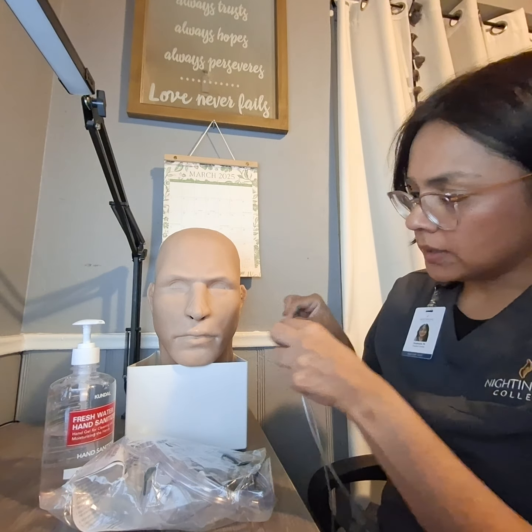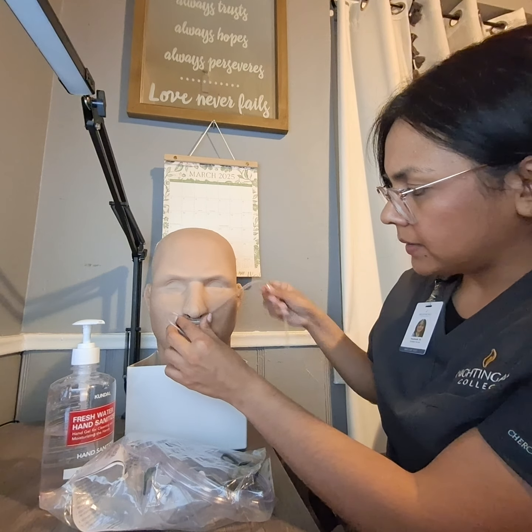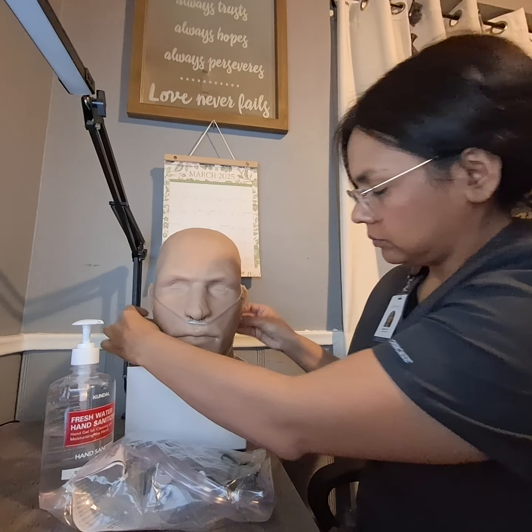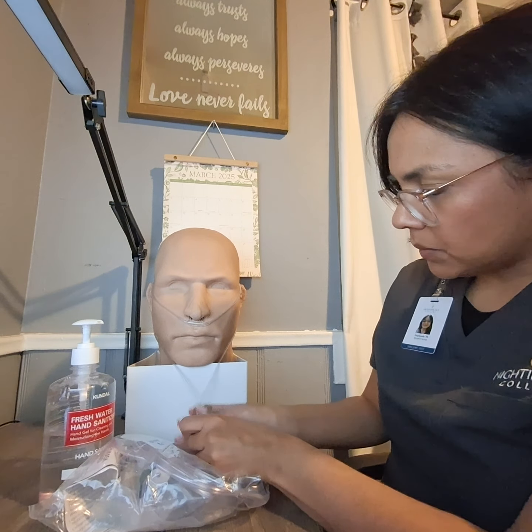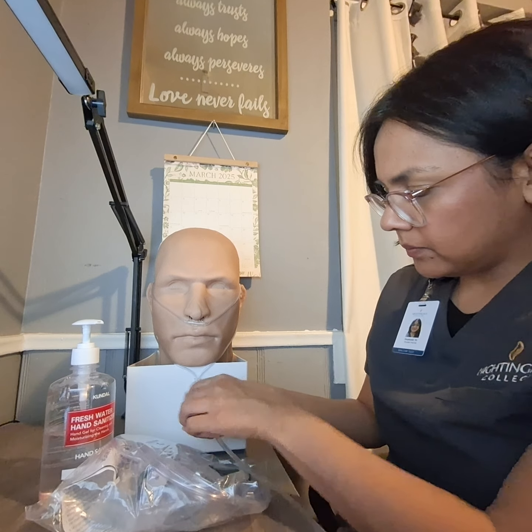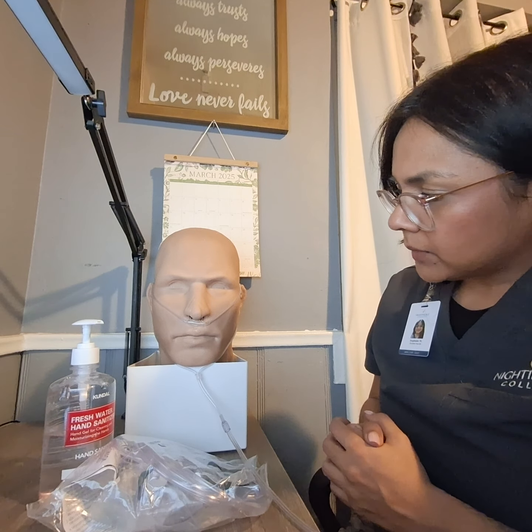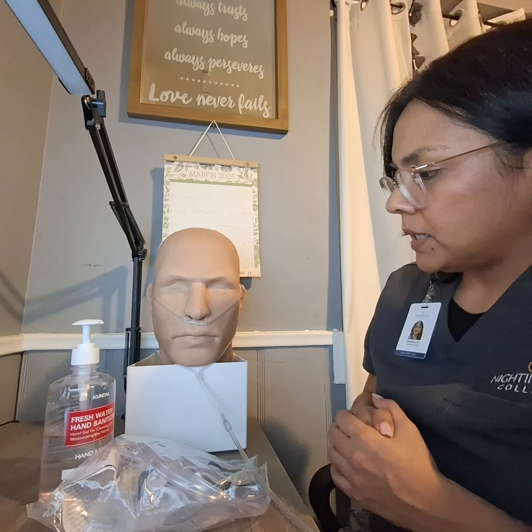I will take the prongs and apply them here to your nostrils, and this will sit around your ears. I will go ahead and make sure that this is nice and tight. How do you feel? All right, sounds good. If you have any discomfort or pain, please let me know.